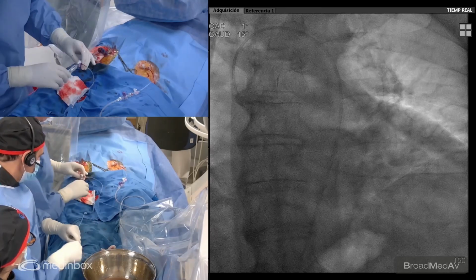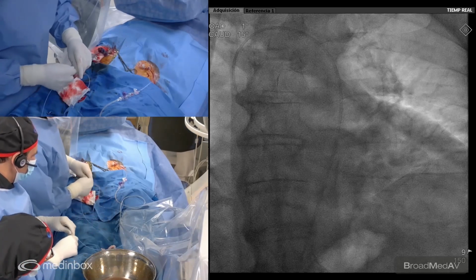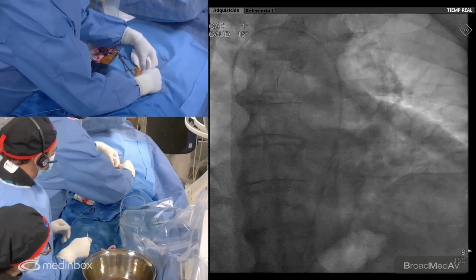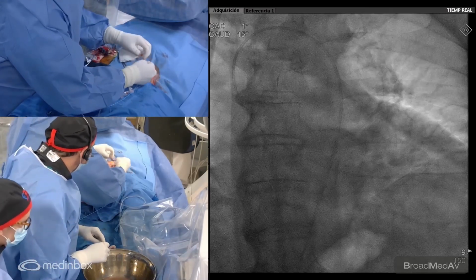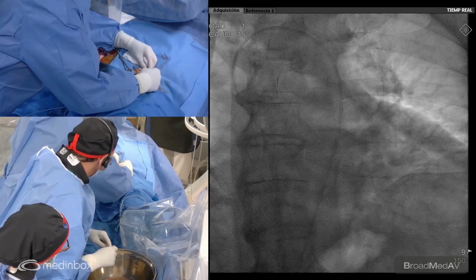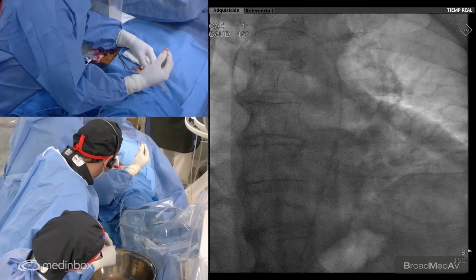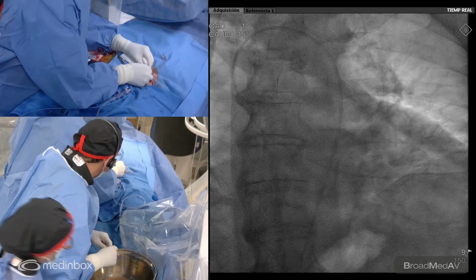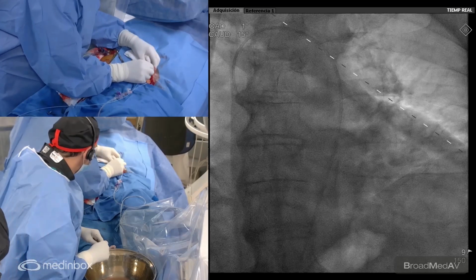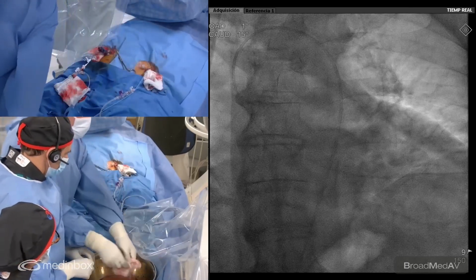Give me some water. So now we are going to position the contralateral pigtail. Give me a big one. Yeah. Give me a second. Okay. Pull a little bit, Carlos. Okay. No. For some reason I have some difficulty here. Don't know. Okay, I am in. Probably it's too late in the afternoon.